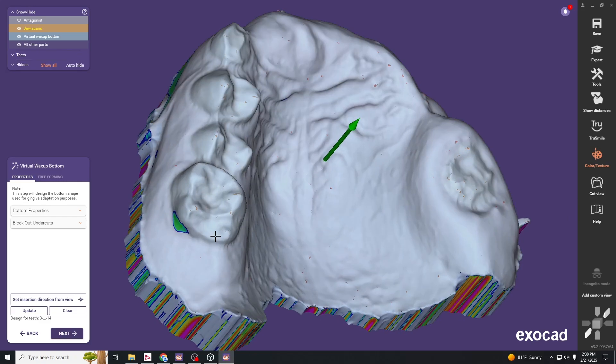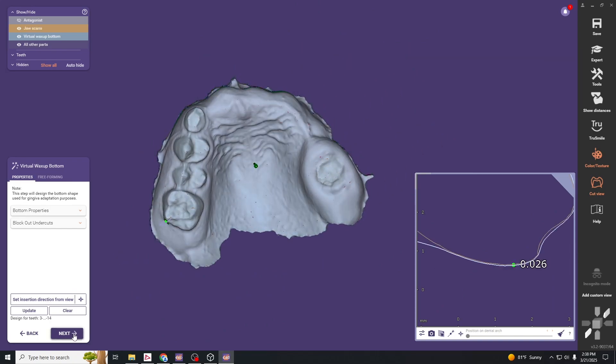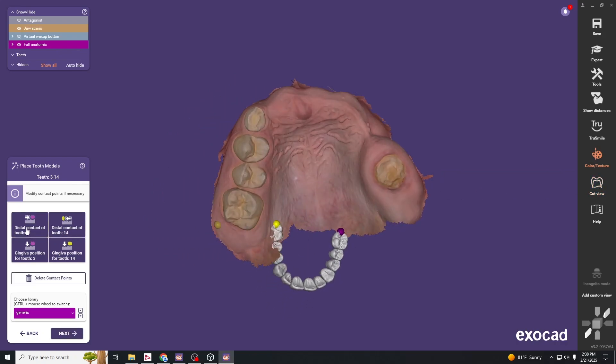This cast will block out any undercuts. If you draw a section here, you can see the undercuts blocked out and it puts an automatic spacer between the tooth and the virtual wax-up layer. Hit OK, and from here we can set our tooth placement.